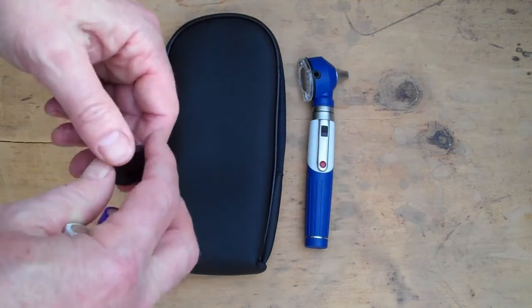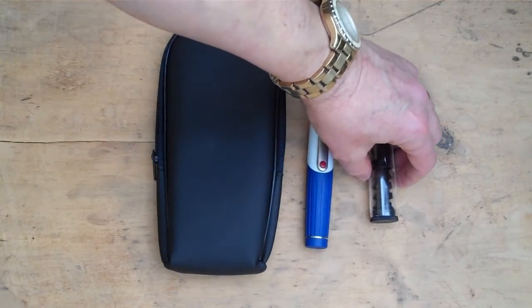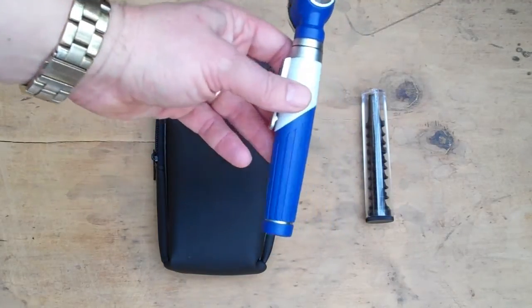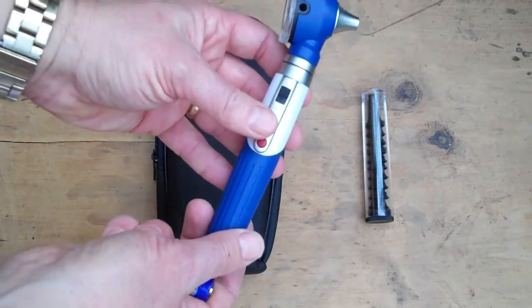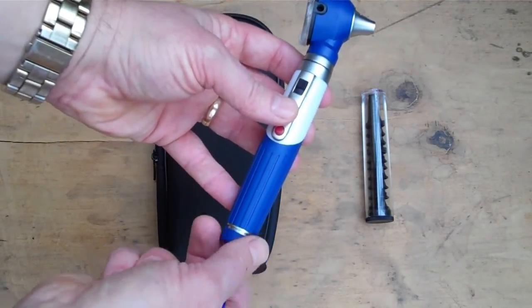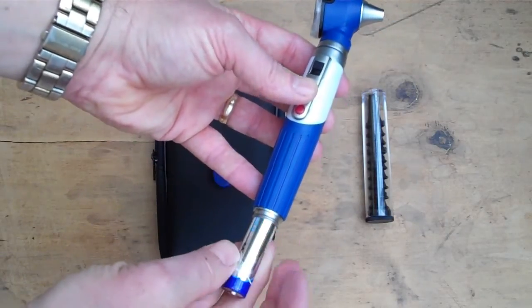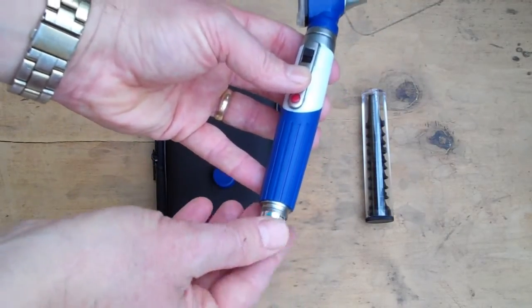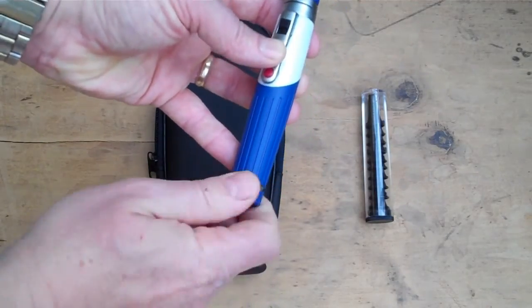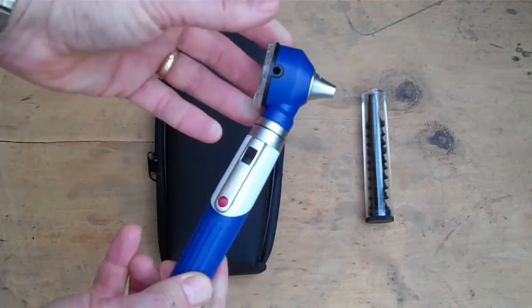The otoscope comes with a pre-packed set of 10 otoscope specular covers in two sizes, so you get both small and large otoscope covers.